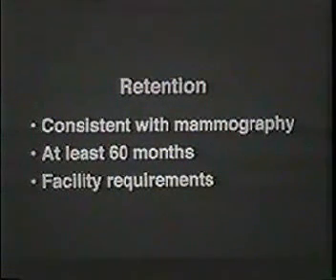In terms of the variations from that, it should be based on facility requirements as well. However, it should never be less than 60 months. Facilities may have different requirements. As long as they're not less than the AIUM and ACR guidelines, that would be fine.